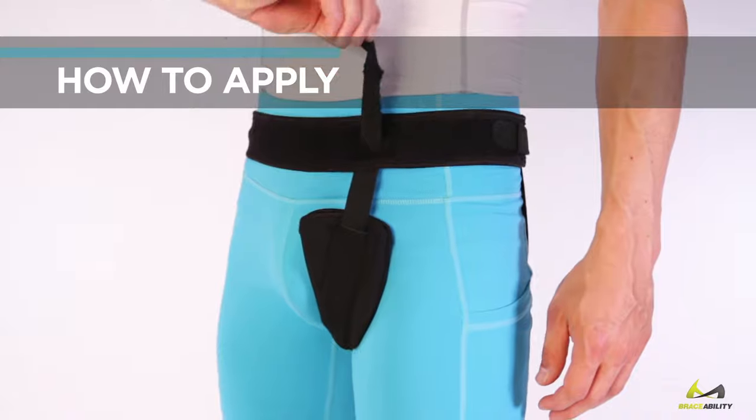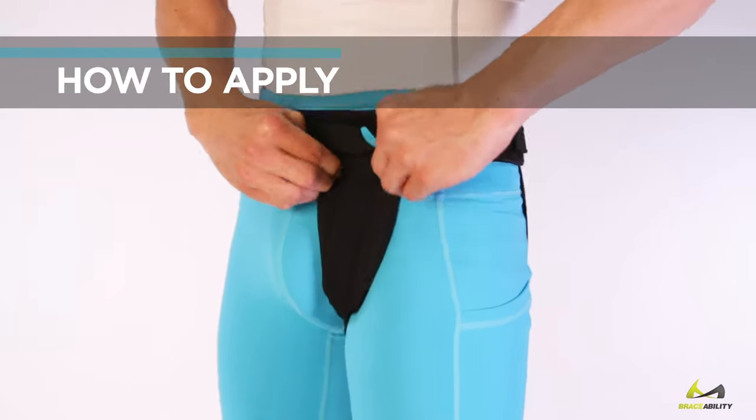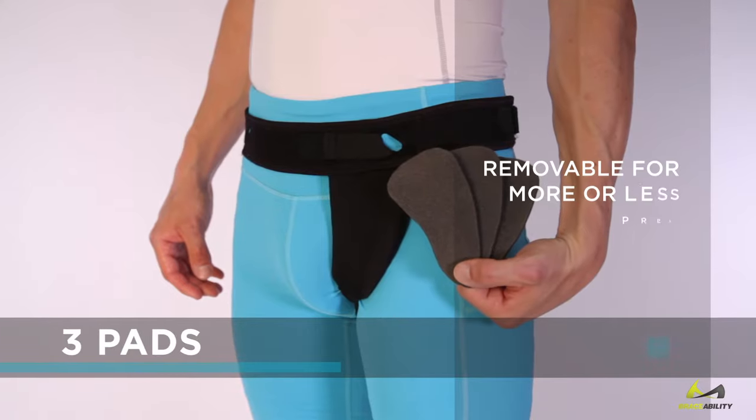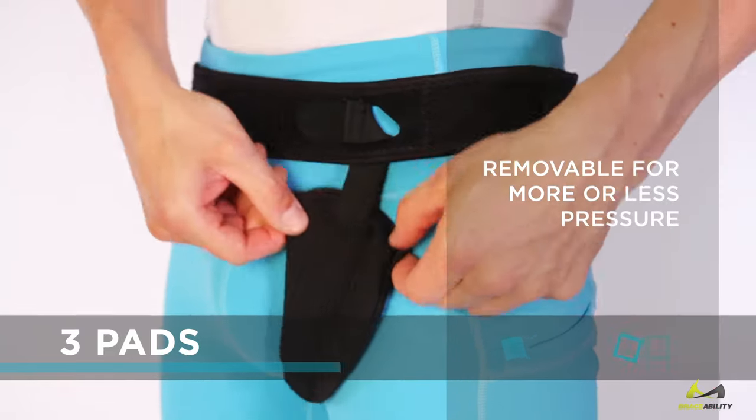Position the waistband at the hips, adjust the tension strap to the desired level, and attach the fastener. Each pocket contains three pads, removable for more or less pressure.